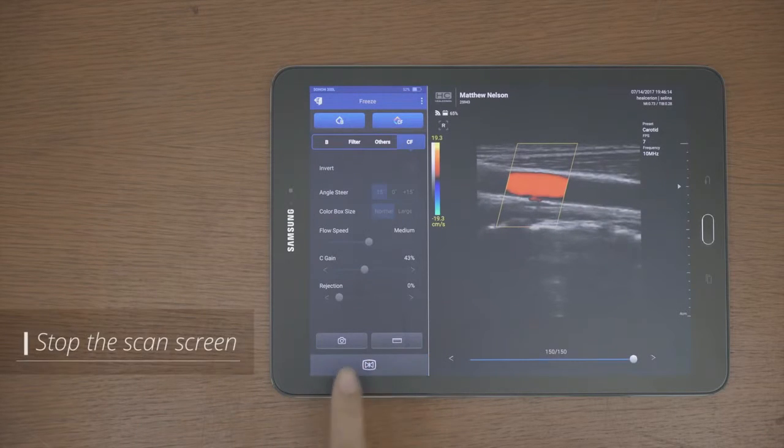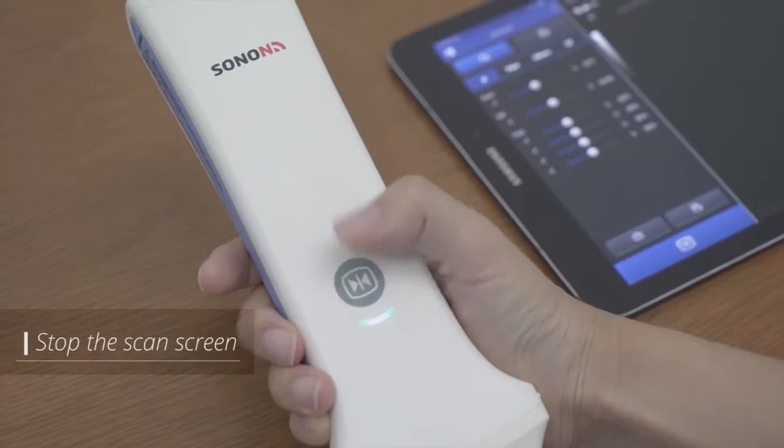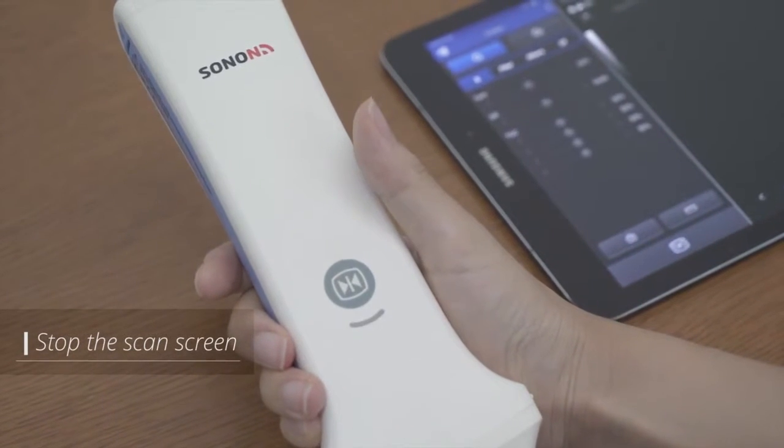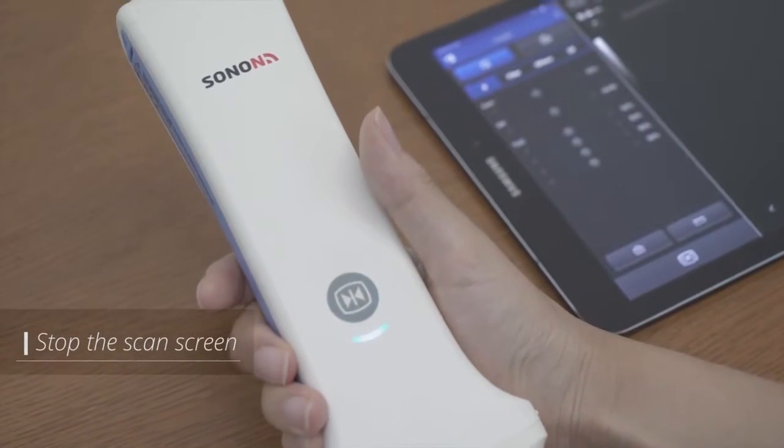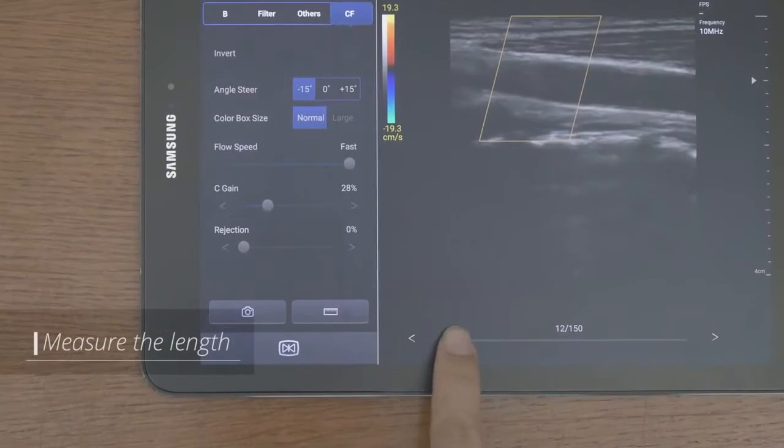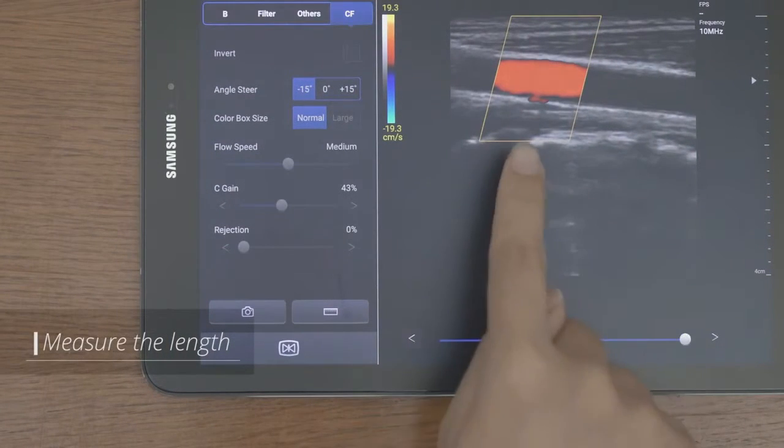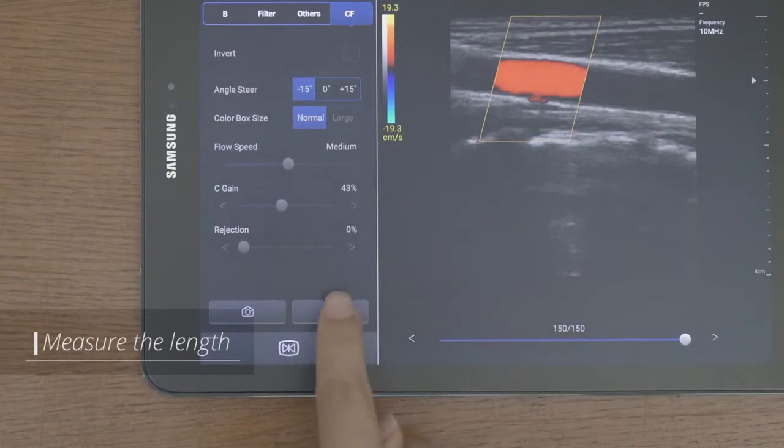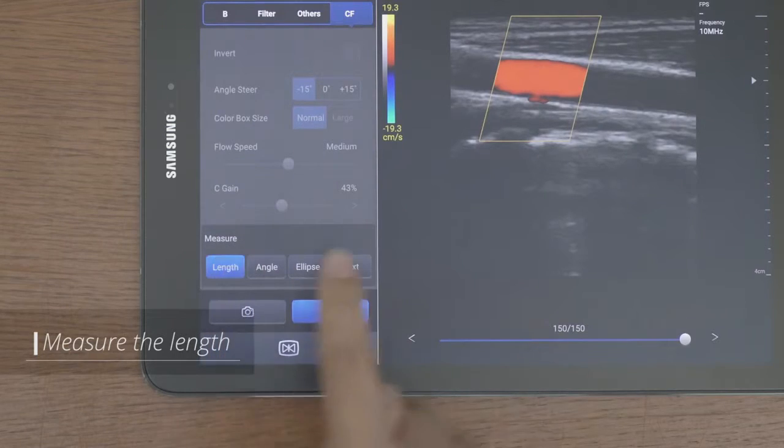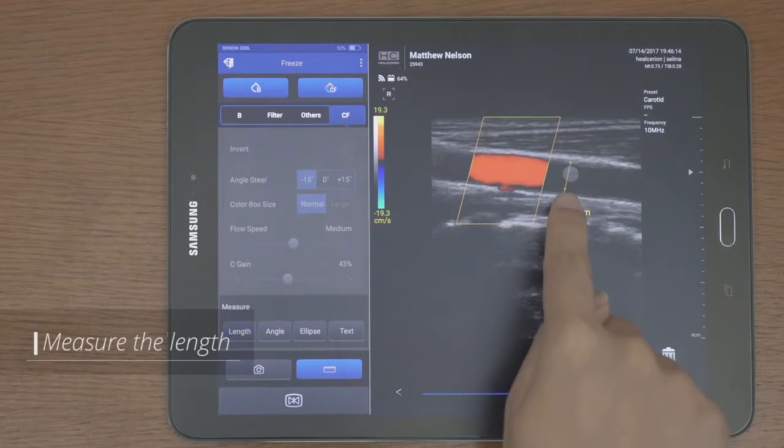You can stop the scan screen by using the freeze button in the app or the button on the front of the device. You can find the desired image and measure the length with the rewind bar which stores the latest 150 frame images.